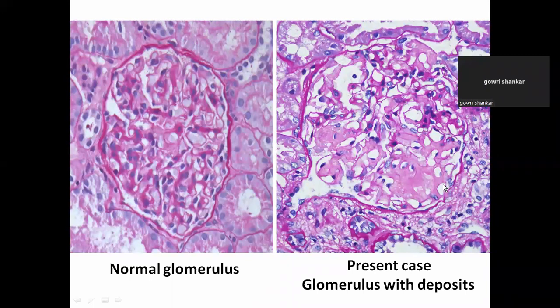Is it mesangiolysis? Okay, a very good morphological differential, I would say, that mesangiolysis you are thinking, because the mesangium is pale. But you have to remember when the mesangium is pale and PAS negative or weakly positive, you should also think of amyloid. Whenever there is mesangiolysis, since you are saying lysis of the mesangium, the mesangium is like a supporting medium, it holds all the capillaries together. So whenever there is mesangiolysis, the capillaries will not have any support and become very dilated and congested. That is not happening in this case. But yes, mesangiolysis will be a good morphological differential here.